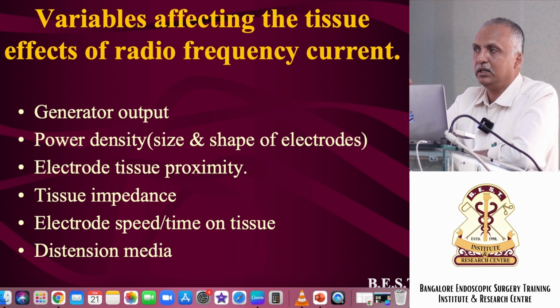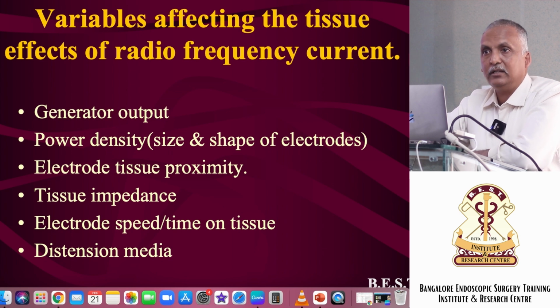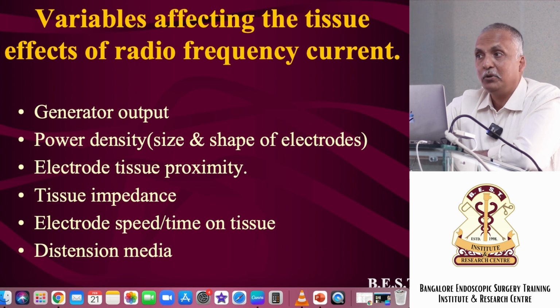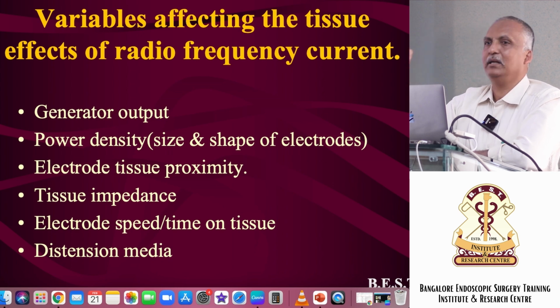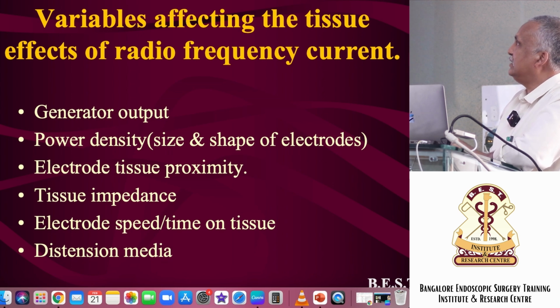You will enjoy it much better than the lower voltage. What I am trying to say is, just because you have a 400 watt electrosurgery machine doesn't mean that you are using 400 watts on that UV fold, but you are doing a much more precise cutting. Okay. So, when you are buying, the higher the voltage machine you are buying, the better it is.